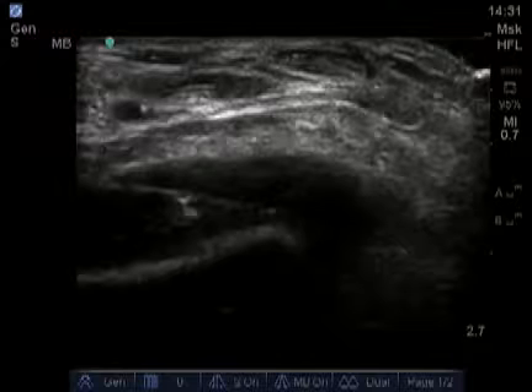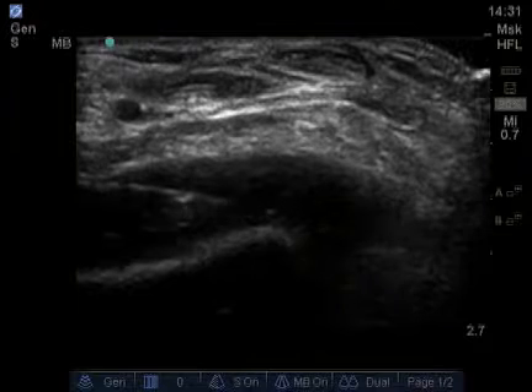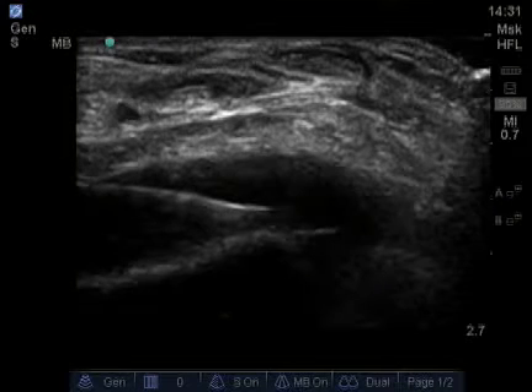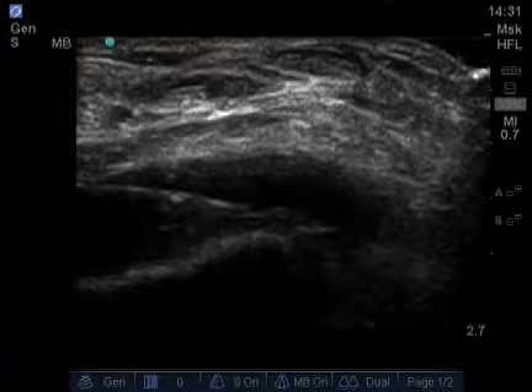In this still image you can see the needle coming down, and as the video plays you'll see the needle advanced in, injected material which you can see circulating around. You can also see the artery pulsating.